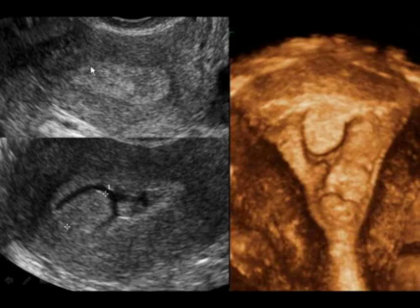Here's another patient who had a thickened endometrium. You can see that not only was it thickened in regular 2D here, but it was also heterogeneous and abnormal. Having put a little bit of fluid in, you can see that there's multiple polyps. Here we're just measuring one polyp, and normally you would have to take quite a few pictures to get all these polyps measured up. But if you take a volume, you can display all of the polyps all together or one at a time, whichever way you want, after the patient has gone, and you can remeasure and re-image those polyps nicely.